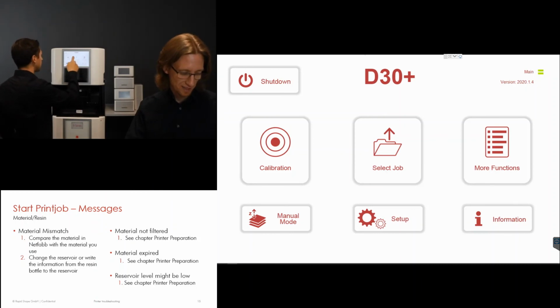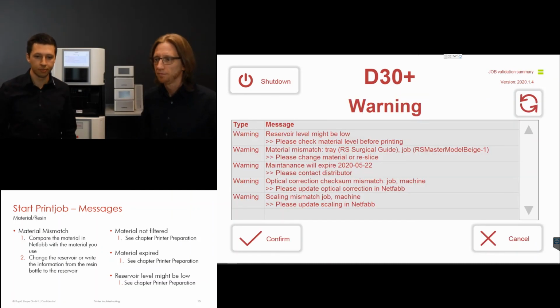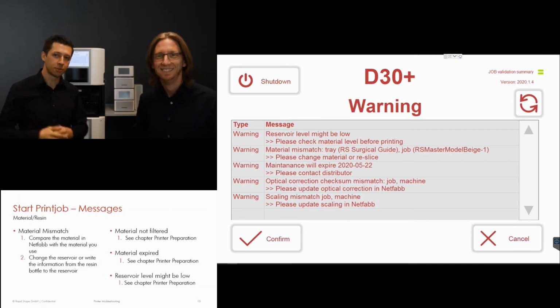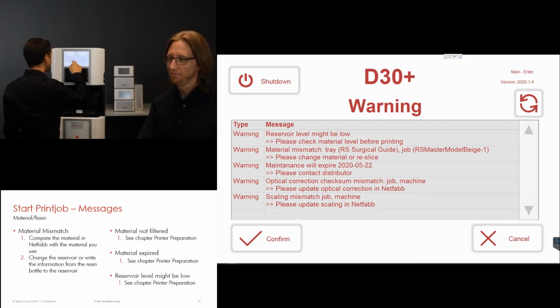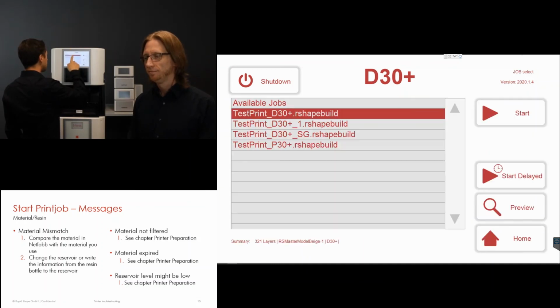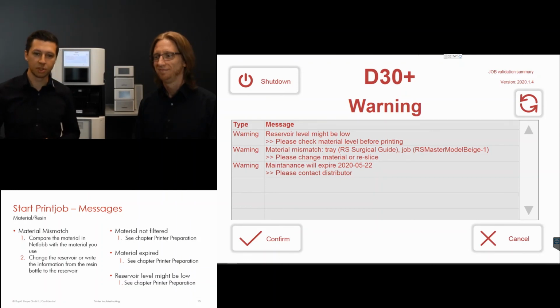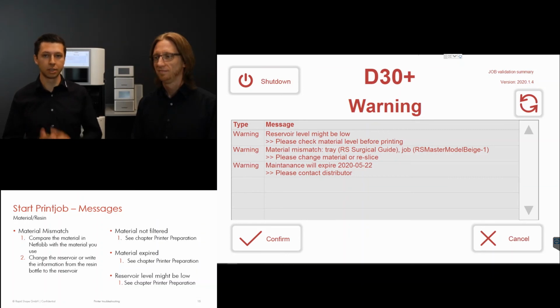That is correct. So I will just load now this job where we still got some issues. Beautiful. We still got the material mismatch, maintenance, and optic correction scaling mismatch. If you have already checked this in NetFab and you change it and reslice the job, this is what I do also. So let's just use the resliced one. I found out that I made some errors in NetFab, so now I can see they are also gone. So we got 3 errors to solve. Maintenance: contact us, we will solve it for you. The other 2 you still can solve on your own, so this is what we told you.